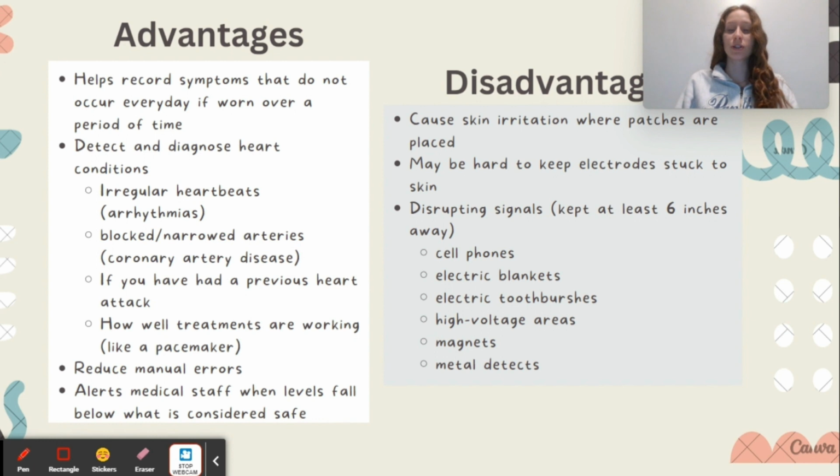It also reduces manual errors of taking different vital signs, and it also alerts medical staff to when levels fall below what is considered safe.